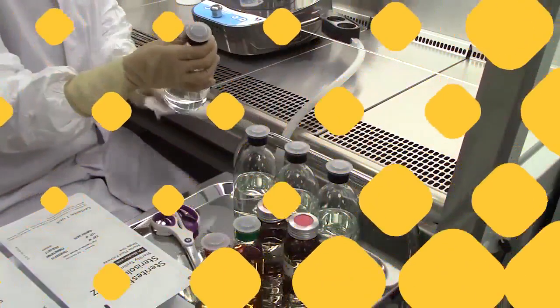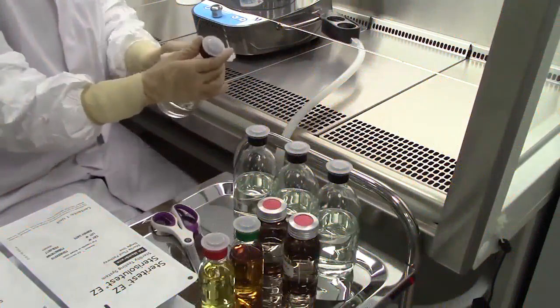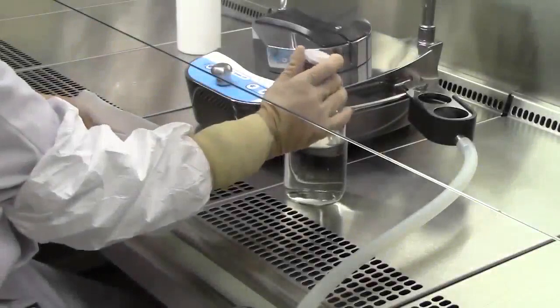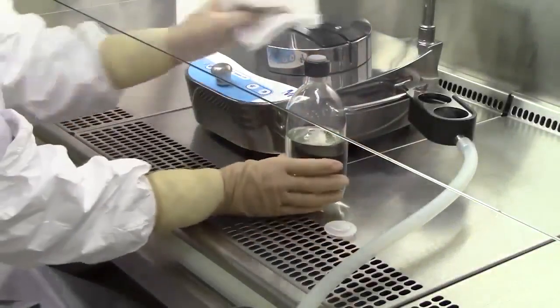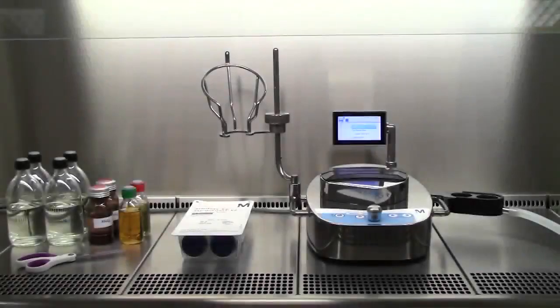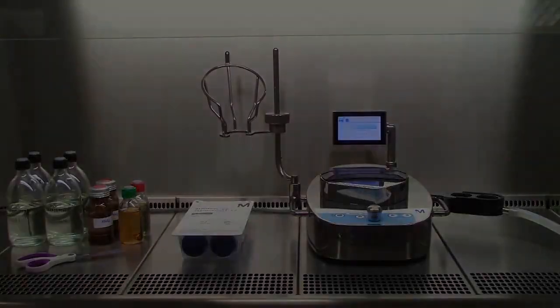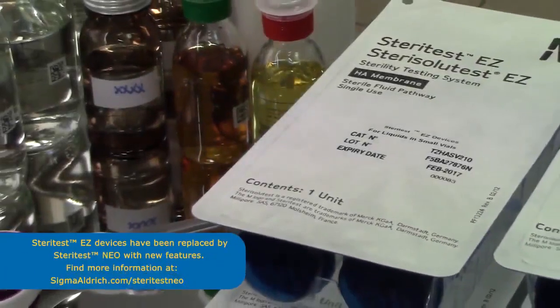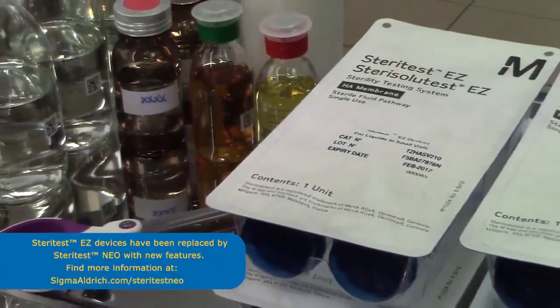All material needed should be decontaminated before being introduced into the laminar flow hood. Remove all plastic covers from bottles and sanitize the lids. The Steritest Symbio pump under the LFH. Steritest Easy devices. Fluids for pre-wetting and rinsing according to the SOP.